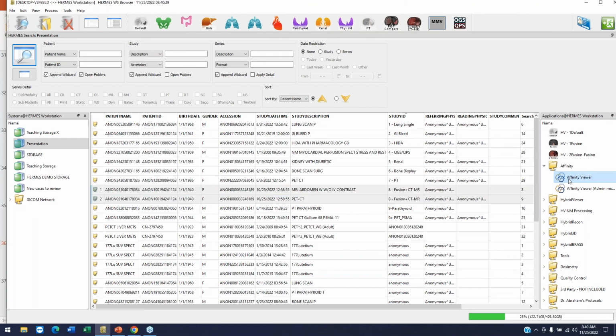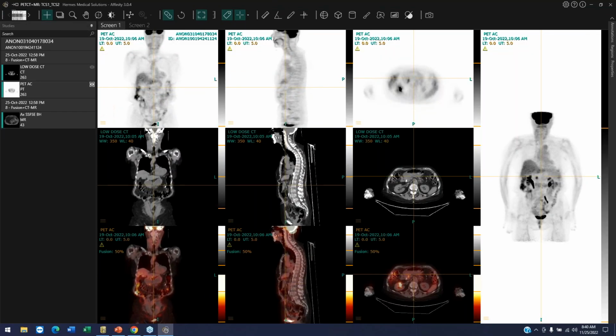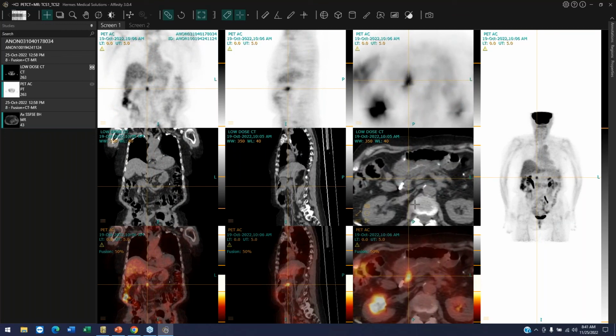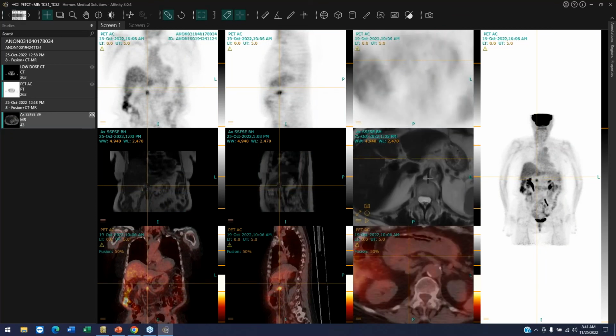Here's an example where a patient presented after having tumor markers elevated with a history of pancreatic cancer and status post Whipple procedure. So this patient had a PET CT and an MRI close to each other, and I will show you. So the PET CT identified a focus in the upper abdomen just right of midline. And if I zoom in on the low-dose CT, it's hard to make out what this lesion is. But since the patient had an MRI, I'm able to grab the appropriate sequence and just replace it on the CT side and automatically co-register it.